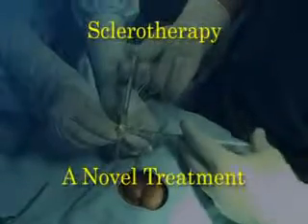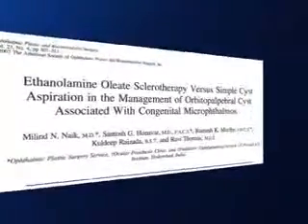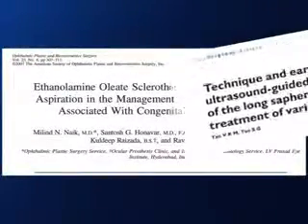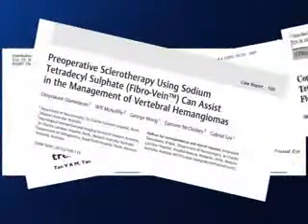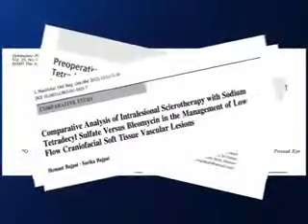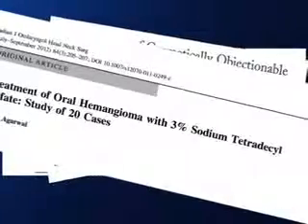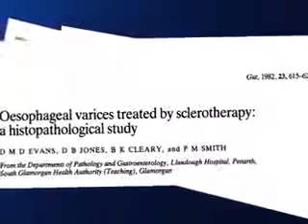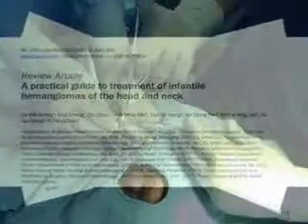The use of sclerosant-based sclerotherapy is a known treatment modality in the management of conditions such as visceral cysts, varicoceles, varicose veins, hemangiomas, hydrocele, and various other cysts all over the body. Closer to the eye, sclerotherapy has also been reported in the management of cystic lymphangiomas and orbitopalpebral cysts. This video highlights the technique followed by our group to introduce this novel therapy.